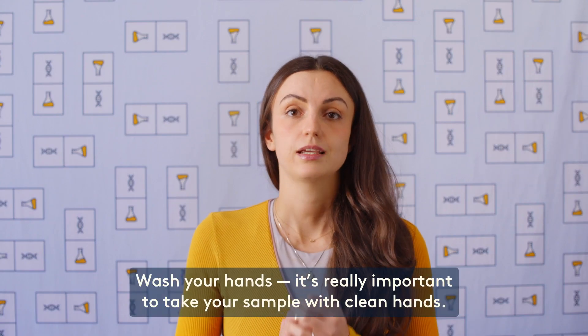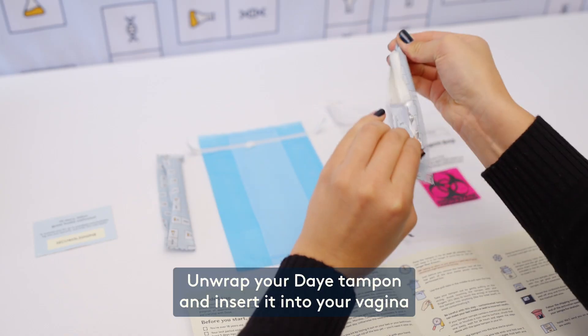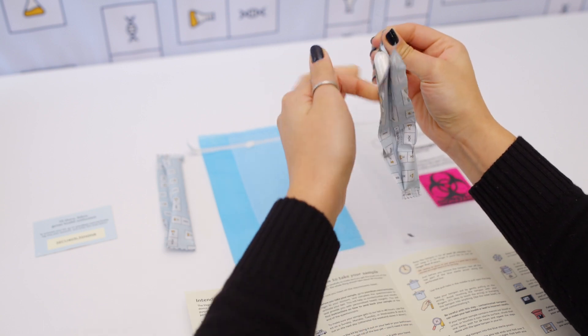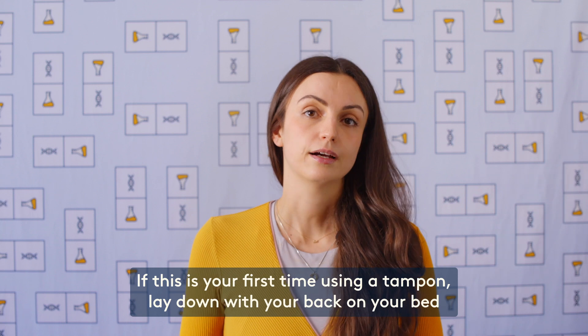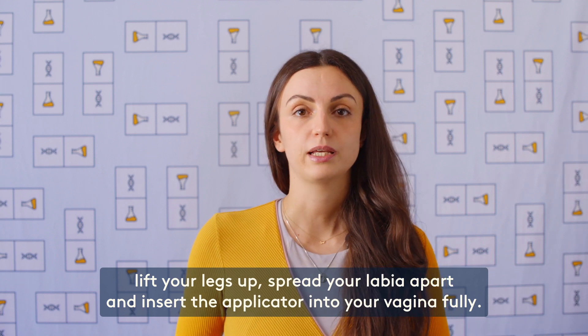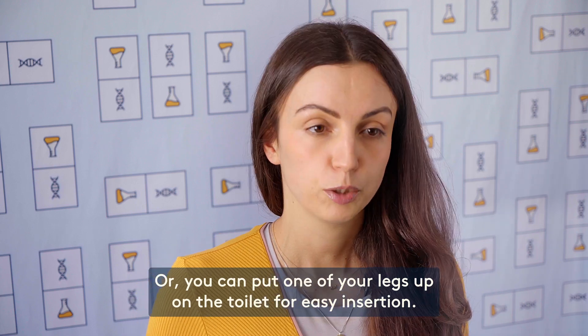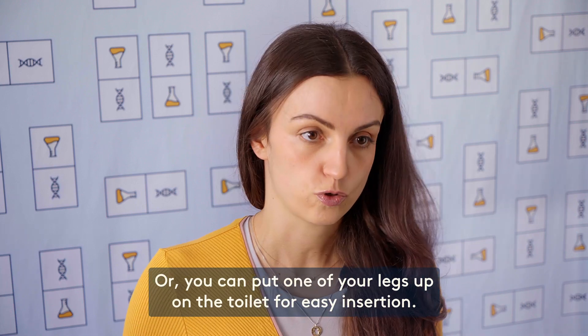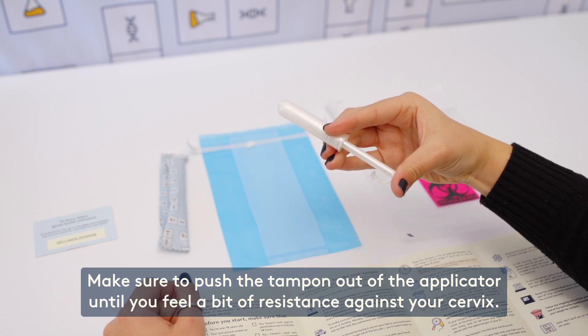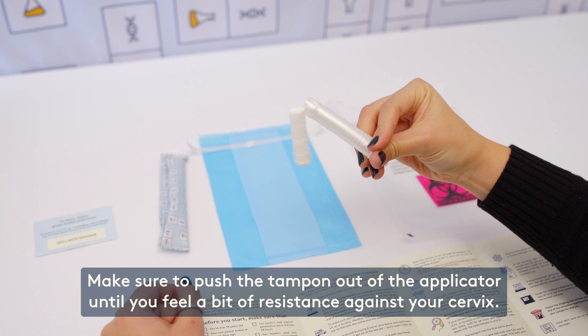Wash your hands — it's really important to take your sample with clean hands. Unwrap your Daye tampon and insert it in your vagina, just like you normally would. If this is your first time using a tampon, lay down with your back on your bed, lift your legs up, spread your labia apart and insert the applicator into your vagina fully. Or you can put one of your legs up on the toilet for easy insertion. Make sure to push the tampon out of the applicator until you feel a bit of resistance against your cervix.